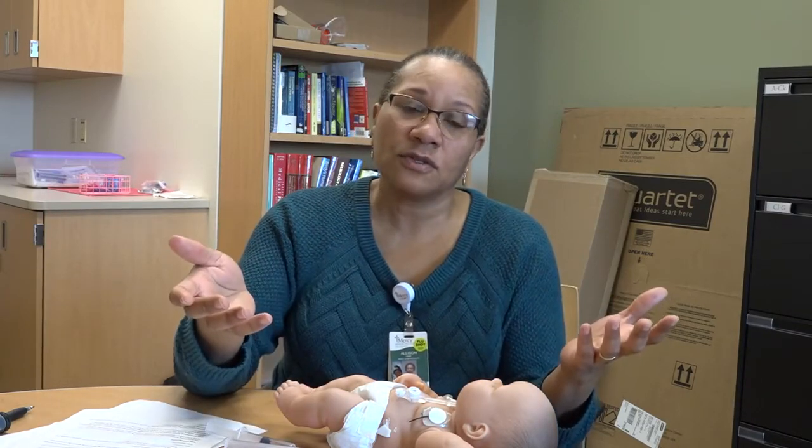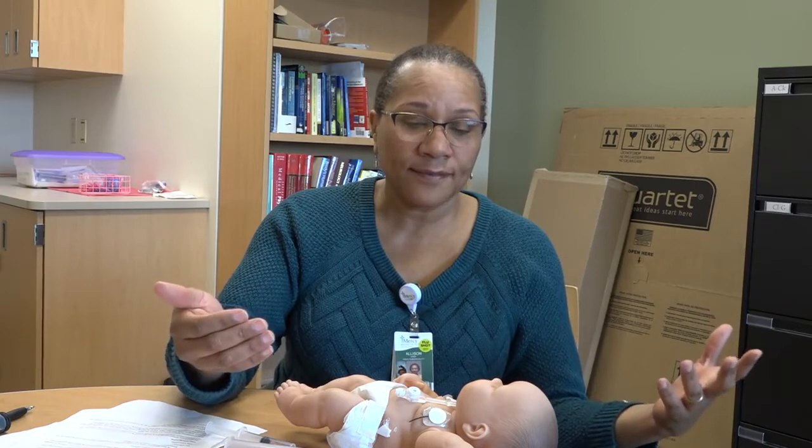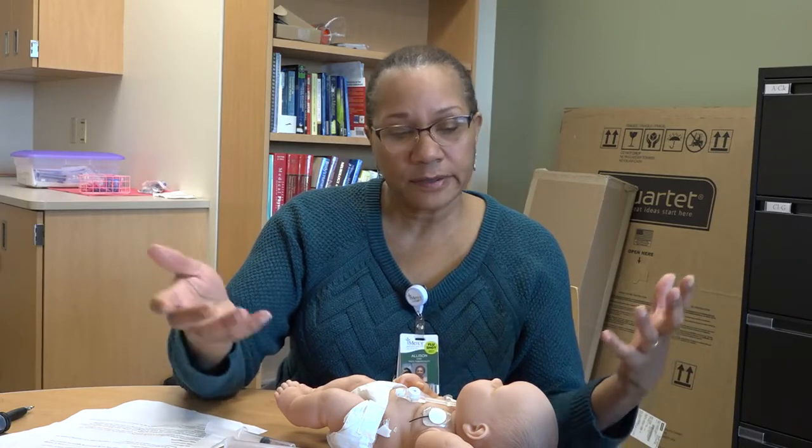So you should have a backup G-tube at home at that time. And I want you to take your backup G-tube with you, but don't offer it when you go to the emergency room. If we have them here in the hospital, then let us use our supply. If it just so happens that we don't have that tube in the hospital, then please go ahead and offer the use of your tube. But just make sure that you have the tube with you, but let us use our supply.